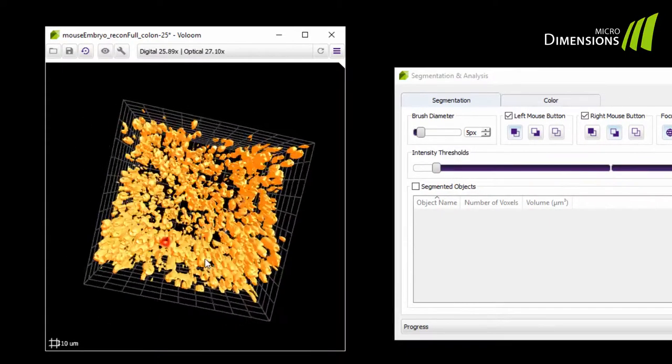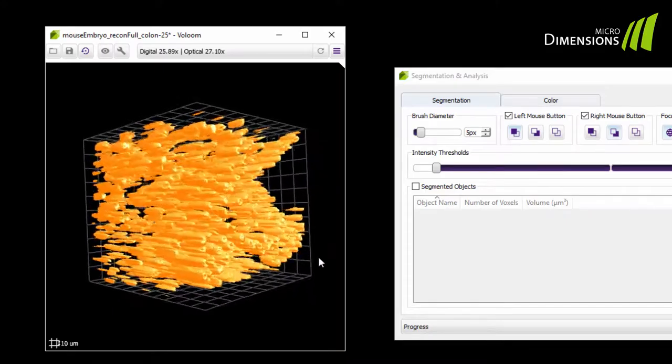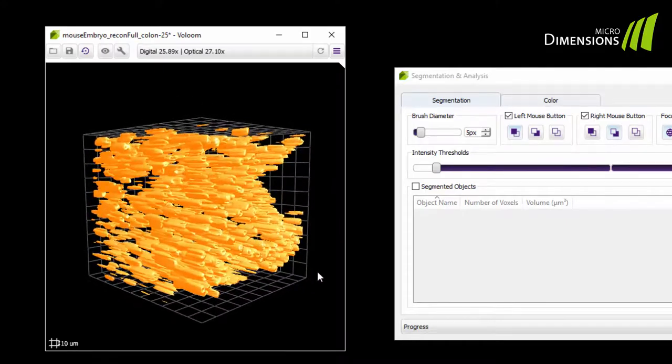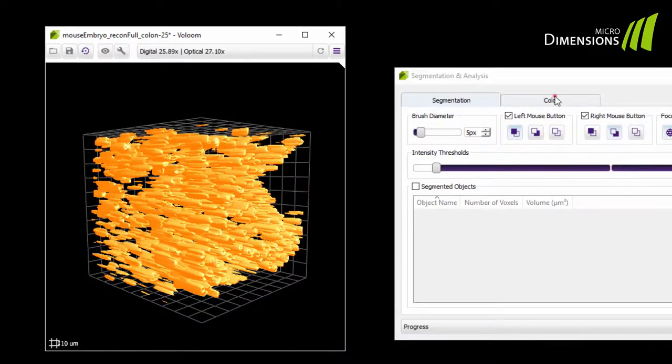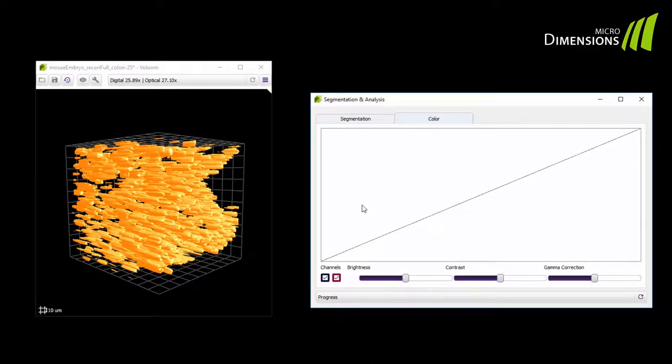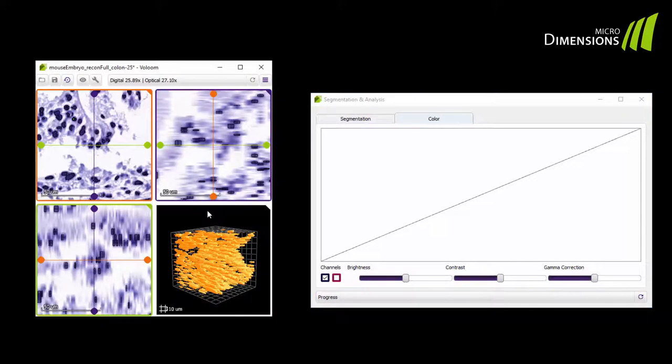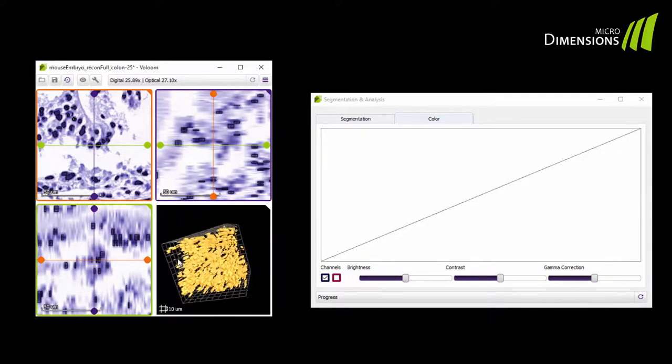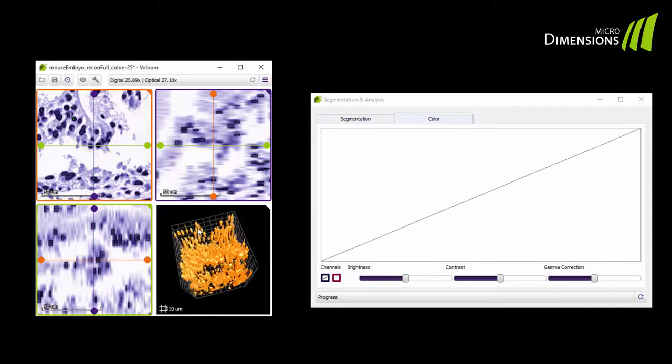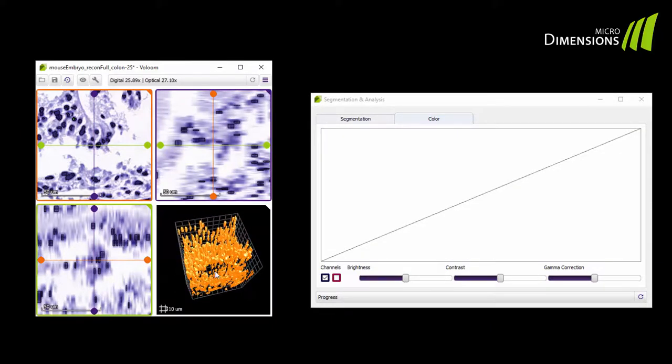Notice that the segmentation is not yet optimal. To refine it you can also employ the color tab. Use the stain separation to separate hematoxylin and eosin and see how the segmentation result is refined.